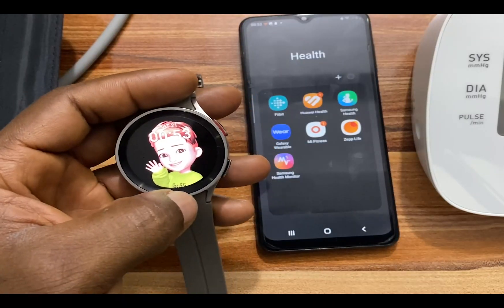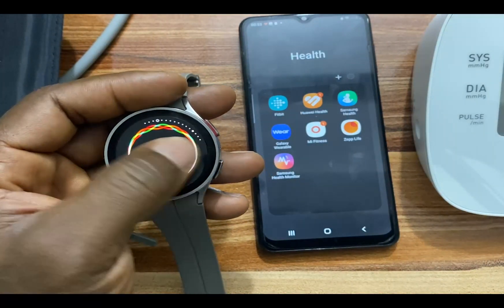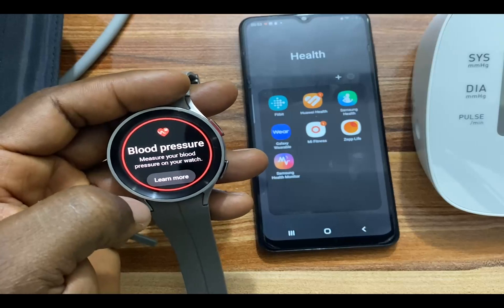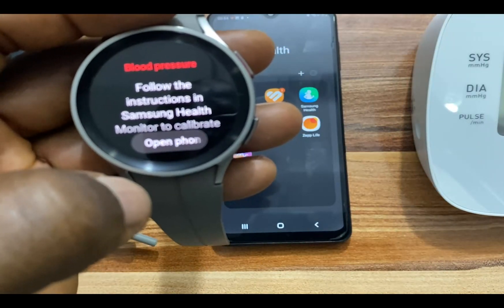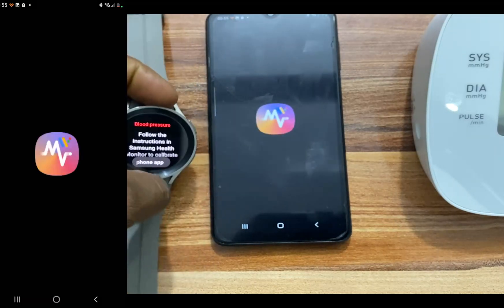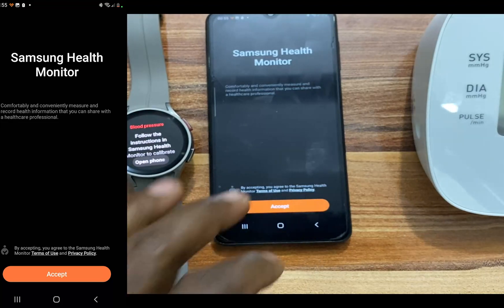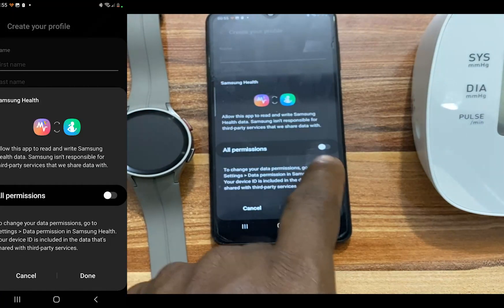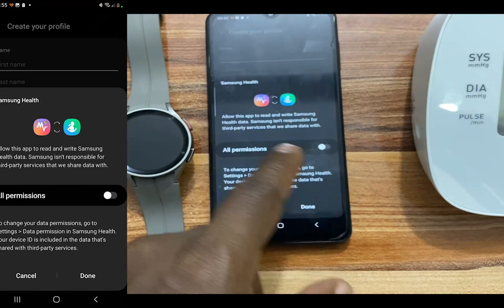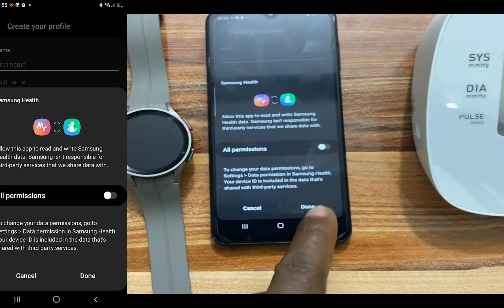To calibrate the blood pressure measurement, I will simply go to the blood pressure app. Tap on 'Learn More', and it says open phone app — this will open the Samsung Health Monitor App. Go to your phone and accept the terms and conditions, and grant permission for Samsung Health Monitor to access Samsung Health. Tap on done.